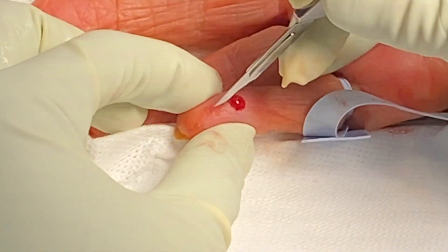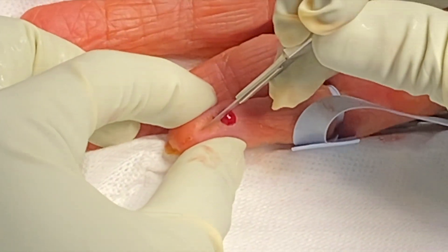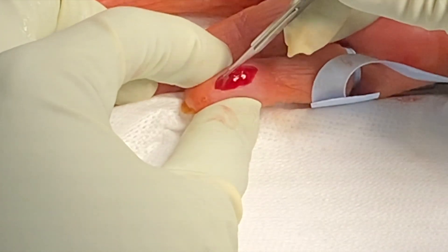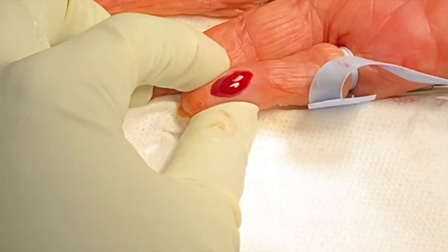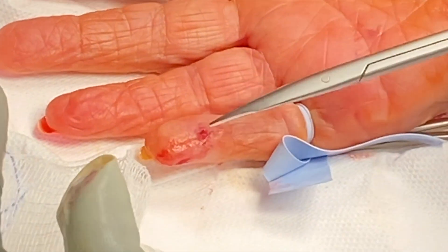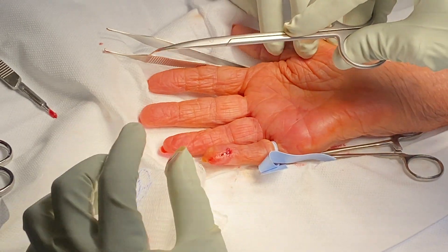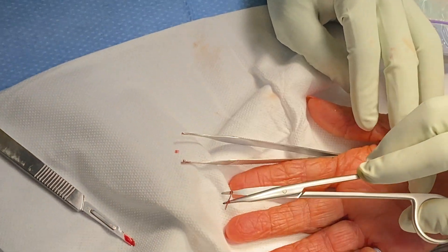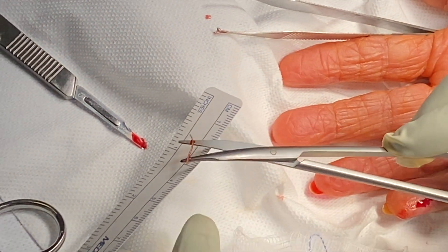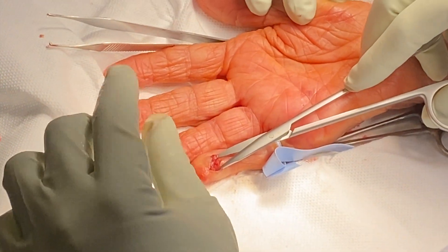At this point in the surgery we've already anesthetized the patient with one percent lidocaine and half percent ropivacaine. We're making an incision with a 15 blade — there were two areas of purulence, one more distally along the distal phalanx and one more proximal. We made an incision connecting the two areas, dissected down with scissors, and almost immediately once we went through the subcutaneous tissue we found this foreign body. It looks like a little hair — it's a splinter from a piece of wood.